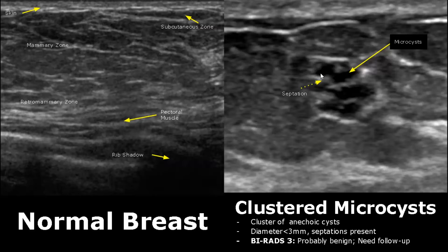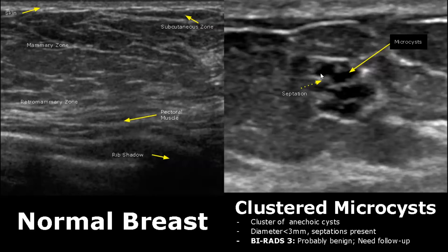Clustered microcysts will have a group of cysts clustered together. The diameter is less than 3 millimeters and septations may be present. It is rated as BI-RADS 3 because follow-up is required.